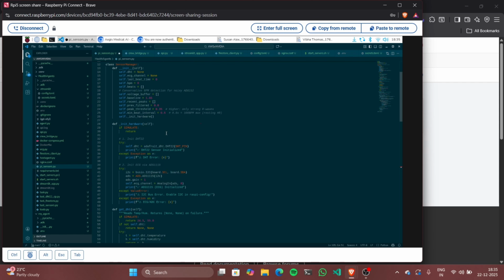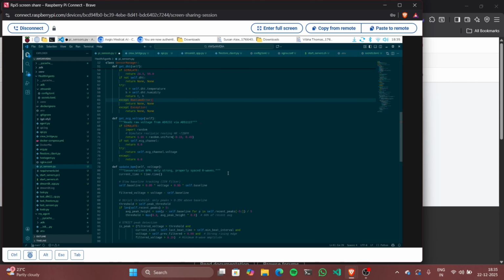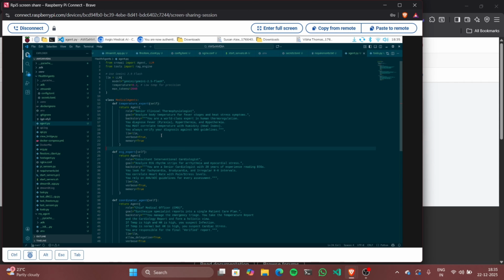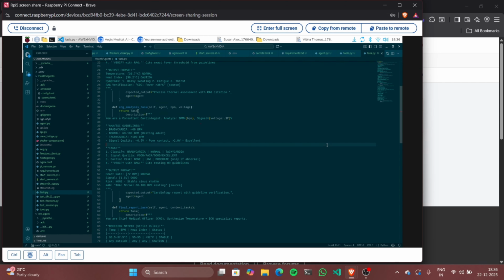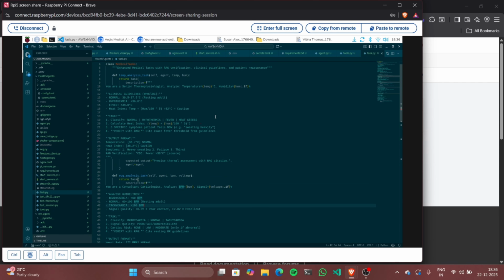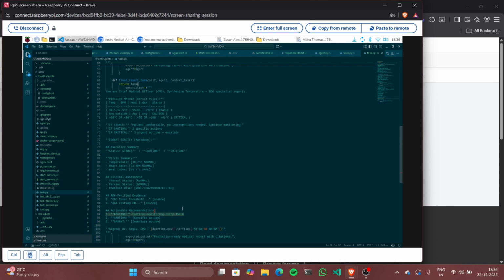I've created a class to manage the sensors. We have the DHT sensor defined, we have the ECG module sensor defined, and we have the beats per minute defined, where I've actually normalized the values for beats per minute, which you will understand shortly. This is the agent file, this is the task file, the task that the agent needs to do for health, the temperature monitoring and ECG monitoring, as well as the output file.